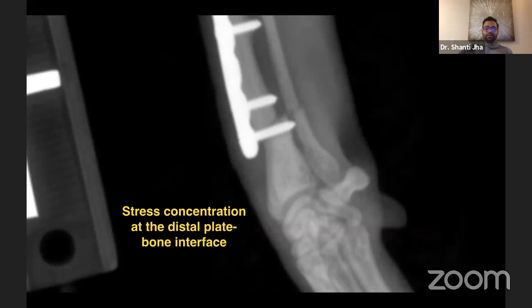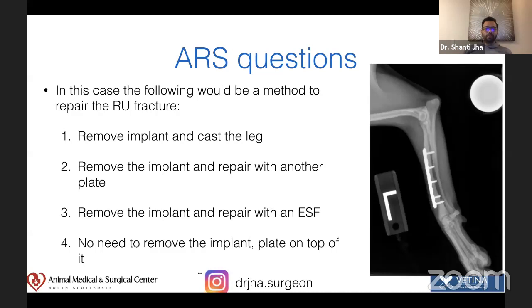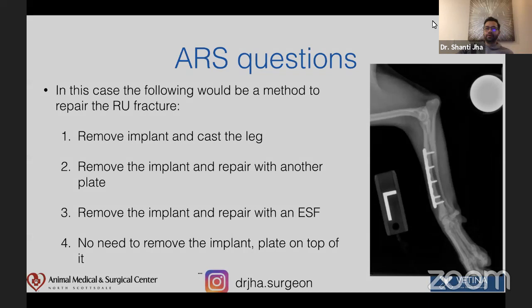So my question here is, in this case, what would be the method to repair a radius ulna fracture? What would you do? Would you remove the implant and cast the leg? Would you remove the implant and repair with another plate? Or remove the implant and repair with an ESF, or no need to remove the implant, just plate on top of it? I'm not sure what you guys will do, but hold on.